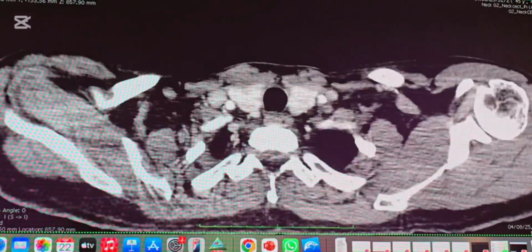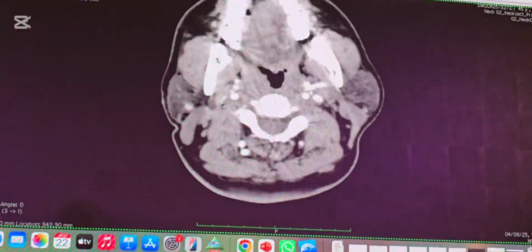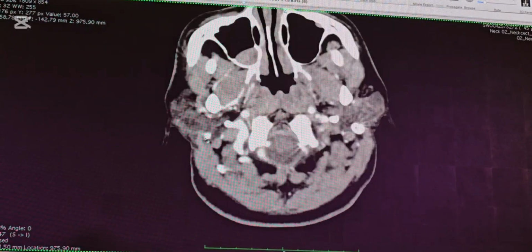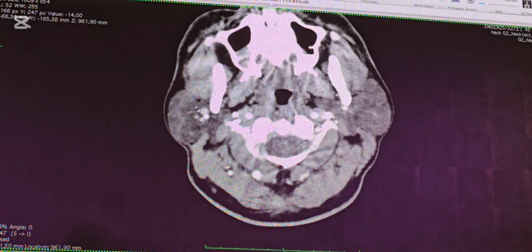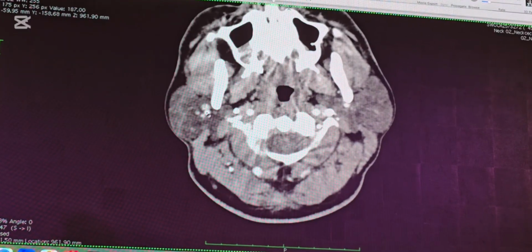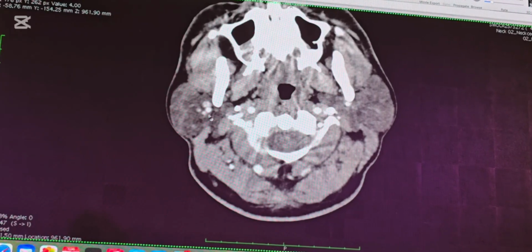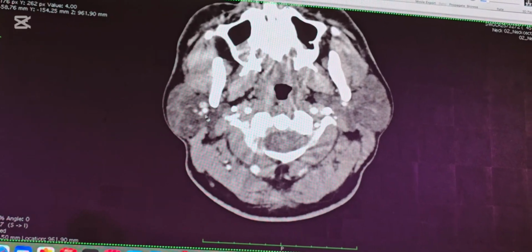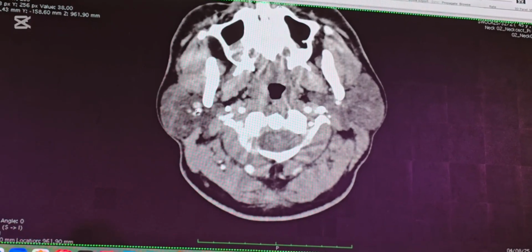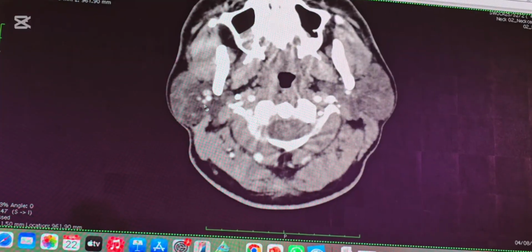Now, muscle, follow the sternocleidomastoid. So there's a mastoid tip. So that's a parotid gland. And inside, a lot of white dots, they are external carotid artery and, what's the vein inside? Retromandibular vein along with external carotid artery.